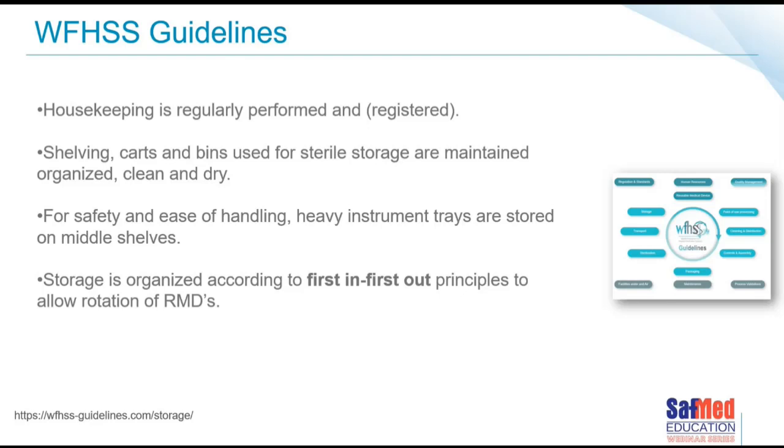Now, I know we want to group our items, so we may be grouping laparotomy sets together, or we're grouping neuro sets together. Yes, very important to group items in a manner that you can understand where they all are. Some people group alphabetically. It really and truly depends on your circumstances. But however you are grouping, please bear in mind that the heavier items should be around middle shelf height, because that's easier from an ergonomics point of view to handle those heavy sets. Of course, a reminder that storage should be organized in a first in, first out principle to allow for rotation of reusable medical devices.